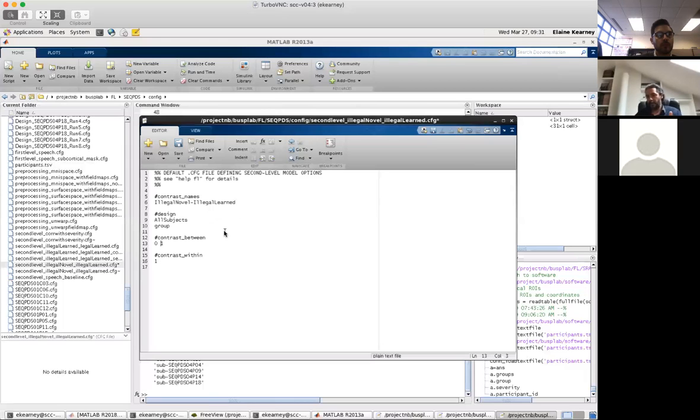So that's a typical scenario where you would add severity in this case, or some other covariate that indicates the thing you want to control for, so basically an ANCOVA type of analysis. If you do an ANOVA, you are comparing two groups, but you want to control for this third covariate that you don't care about, and you want to disregard those effects. In this case, it probably doesn't make that much difference because the severity index is the thing that is most related to the issue at hand in your patients, right? So if you're looking at the study and the severity, I imagine, I'm not totally sure if I recall the details of your variables here.